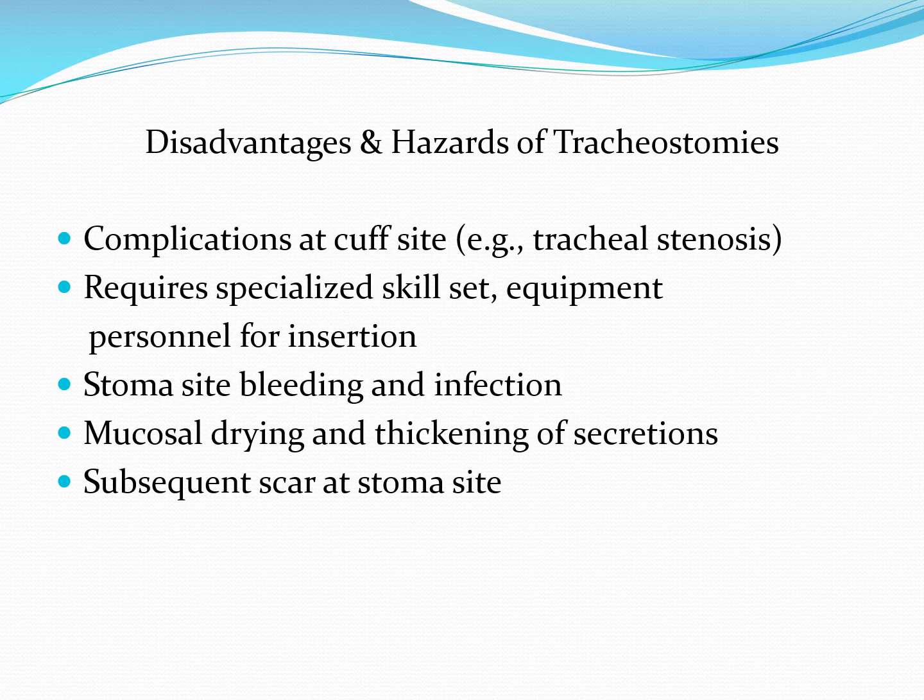So you can have much drier gas, particularly in the winter months, going into the airway, accounting for evaporation of the moisture in the mucosal wall and thickening of secretion. Subsequent scarring at the stoma site itself: once the patient is decannulated, they may now have a depression there or a scar.